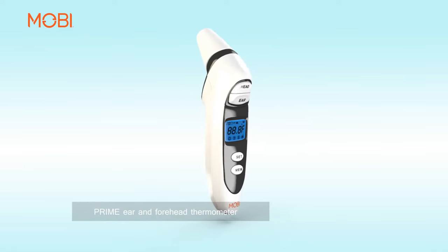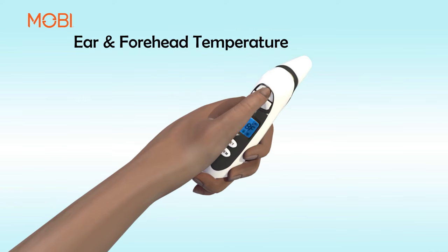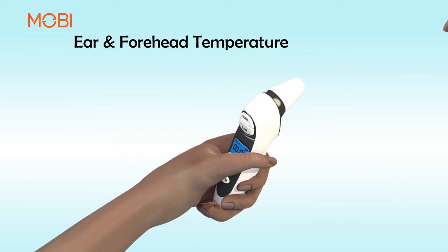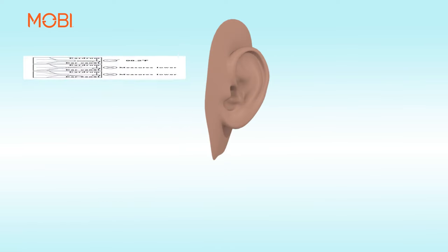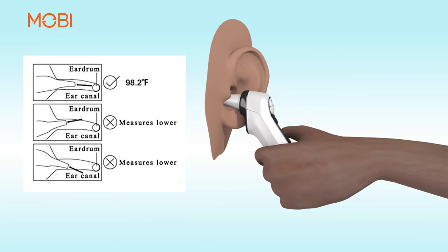Prime Ear and Forehead Thermometer — Ear and Forehead Temperature. Press the head button to turn the thermometer on. To measure temperature via ear, pull off the forehead probe cover from the unit. Insert the ear probe tip slightly into the ear opening, then press and release the ear button to measure the body temperature.